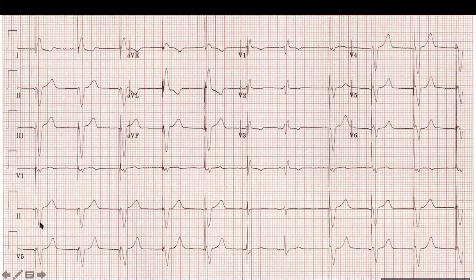We'll go back again. So lead 2, this is the intrinsic rhythm, right? Yes. Okay. So if the pacemaker did give an impulse over here, the next impulse should be probably around here. Yes. But why is there no pacing spike over here? Because of the inhibition. Exactly, inhibition.